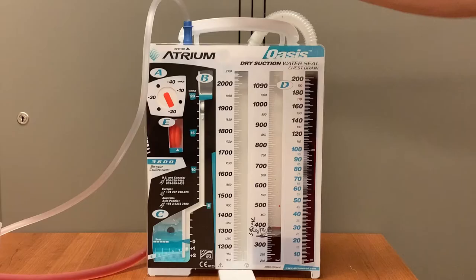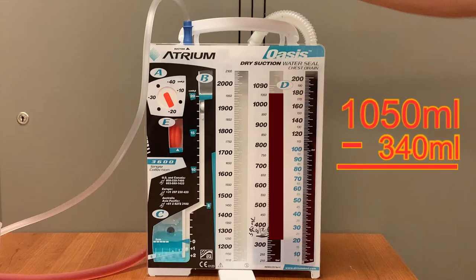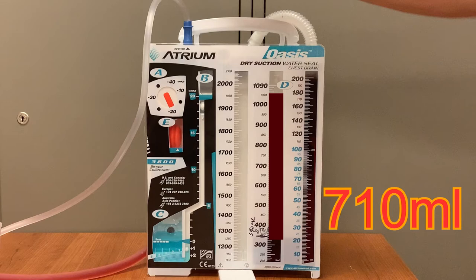But what if you take over a patient and have an Oasis system that was already set up and already has fluid in it? Over the course of your shift, it continues to fill to a total of 1,050 milliliters. Do you chart 1,050 milliliters? No — you'll want to chart the amount that drained during your shift only. As long as the previous nurse marked the container at the end of the previous shift, this is an easy process. Take the 1,050 milliliters and subtract the 340 milliliters that were already present at the beginning of your shift. This way, you'll discover 710 milliliters of that drainage fluid came out during your shift, and in EPIC you chart 710 milliliters of output.